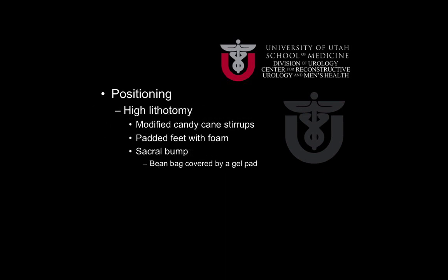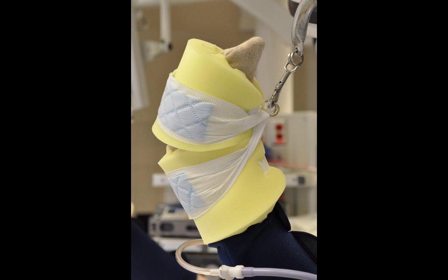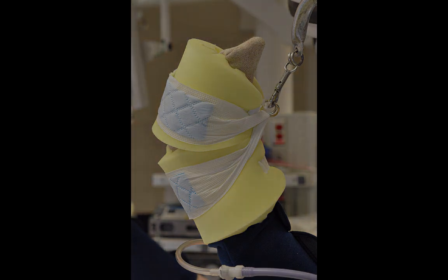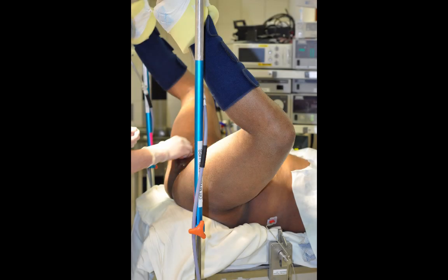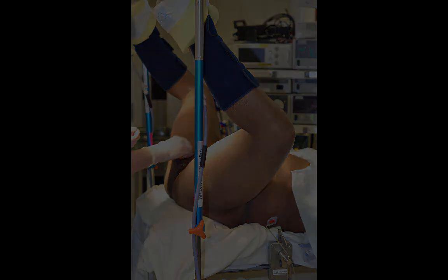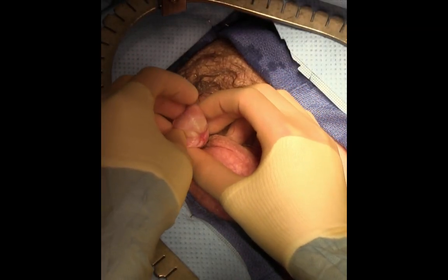The first consideration in the procedure is positioning the patient. We prefer the high lithotomy position. We use modified candy cane stirrups that have some extra length added to the candy canes. We pad the feet with foam, and we use a sacral bump consisting of a beanbag covered by a gel pad. However, multiple methods can be used to position the patient in high lithotomy, including some bath blankets underneath the sacrum and yellowfin stirrups. In our patient, the etiology of his urethral strictures is lichen sclerosis.